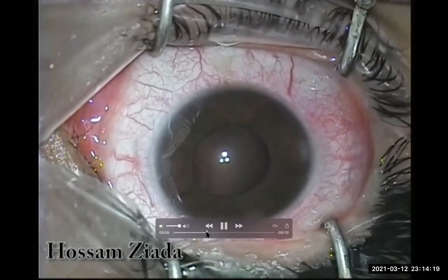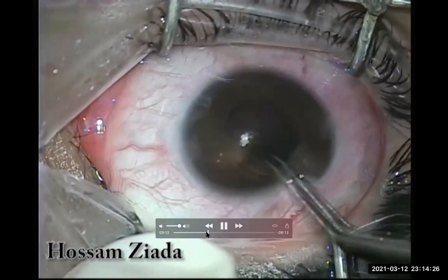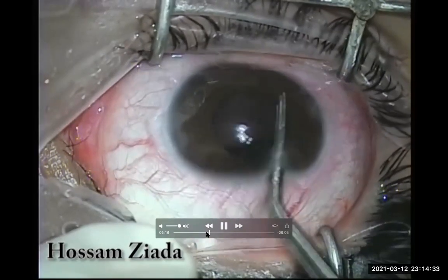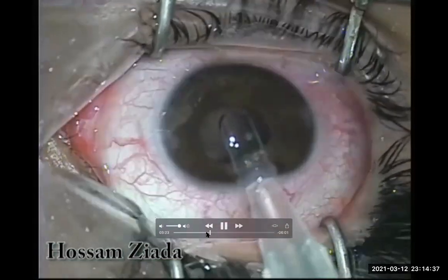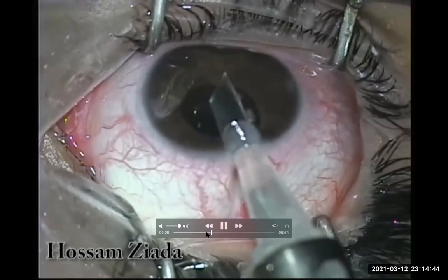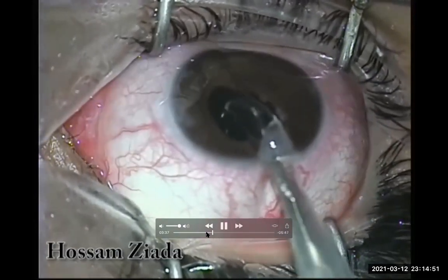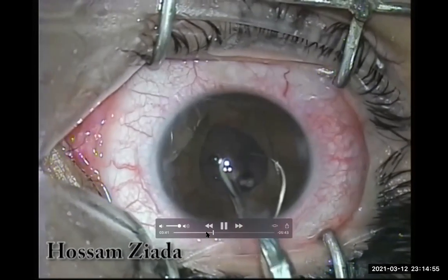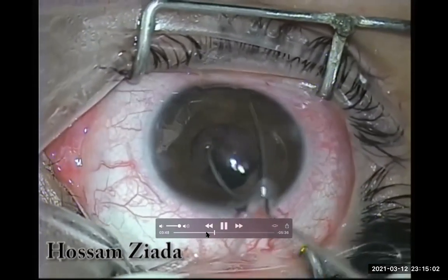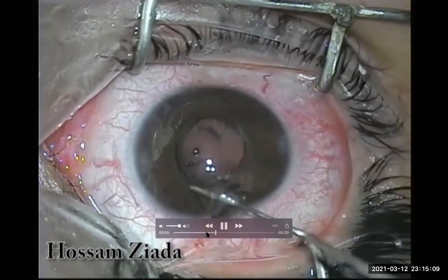I injected pilocarpine intracamerally but it didn't work well, so I'm trying to constrict the pupil mechanically by pulling it all around. Then I'm injecting the three-piece foldable IOL into the anterior chamber. Be careful to ensure the landing haptic remains in the anterior chamber — otherwise it will go posteriorly. I will keep both haptics and the optic in the anterior chamber initially.